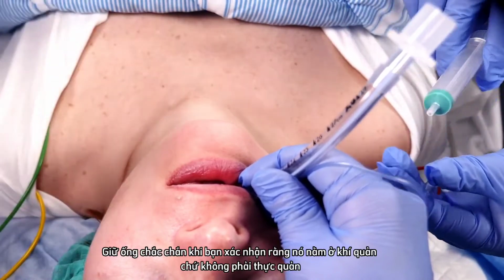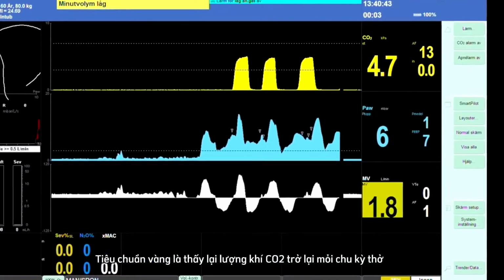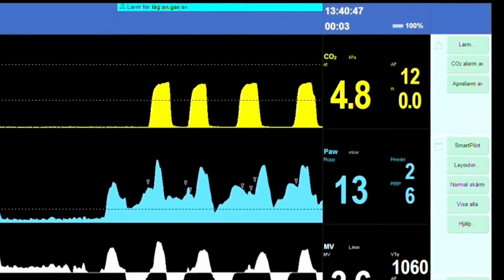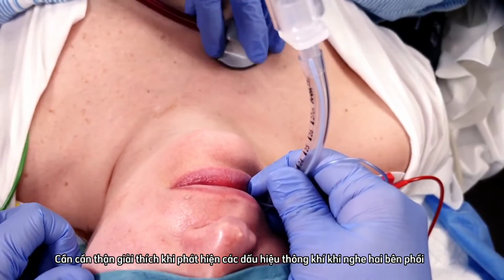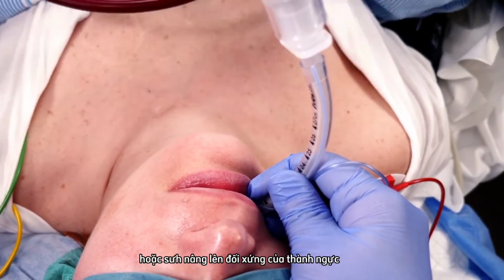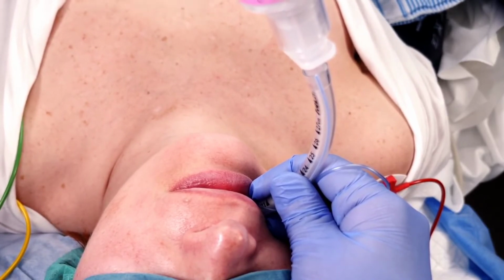Hold the tube firmly while you confirm that it's lodged in the trachea and not the esophagus. The gold standard is return of end-tidal carbon dioxide over several respiratory cycles. Be very cautious when interpreting the other signs traditionally used: auscultation on both lungs, condensation in the tube, and the symmetric rise of the chest wall, as these may very well be positive despite an esophageal intubation.